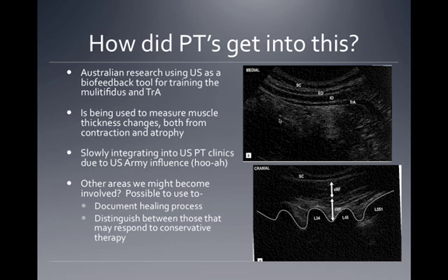But what else might we use this for in the future? Some of the things that we've looked at doing some research on is looking at healing. So let's say something like a rotator cuff tear. Right now all our rehab protocols are really based on time and symptoms.